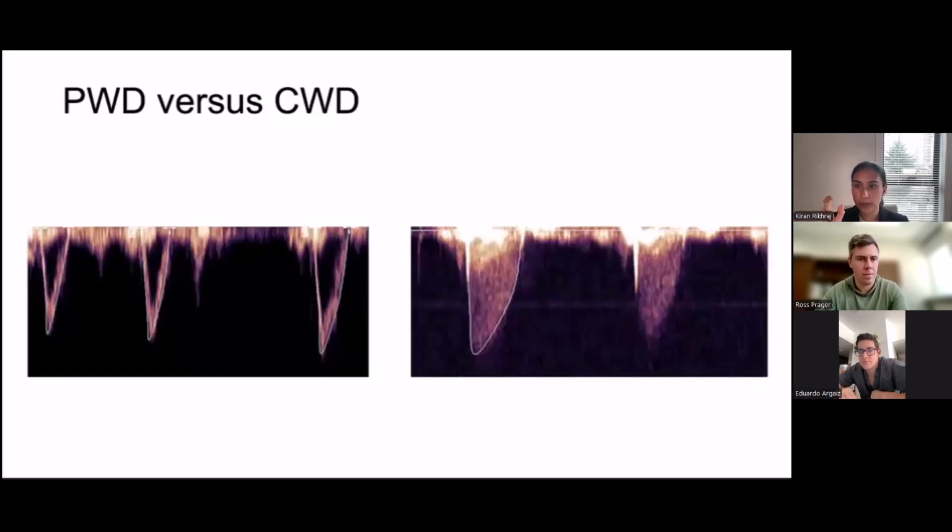So when you're using pulse wave Doppler, it can measure the velocity at a specific point, which is the point of your interest. And when we talk about VTI, we really want to know the speed of blood at the LVOT, which is just proximal to the aortic valve annulus. The important thing about pulse wave Doppler is that it is limited by speed. So it can only really accurately detect speeds of about 1.8 to 2 meters per second. Anything beyond it and the pulse wave Doppler signal, I like to say, gets confused and it cannot accurately detect the speed and the direction of blood flow.